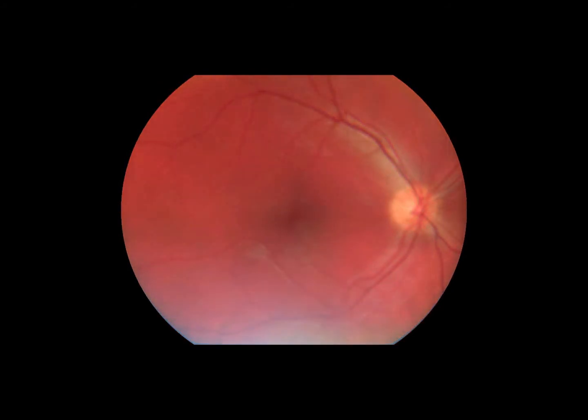If the image is not in focus, take a new image with a changed focus range or focus mode.